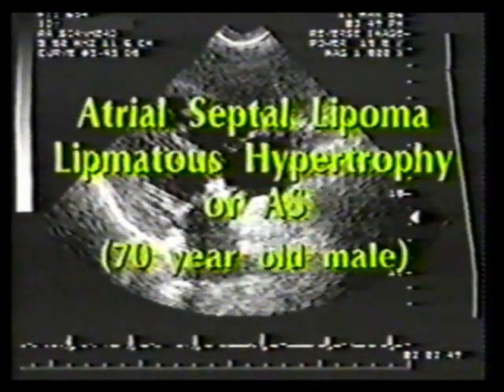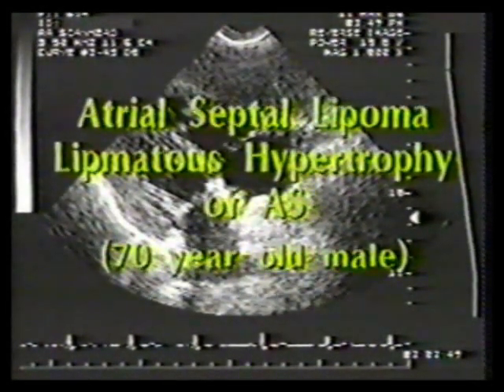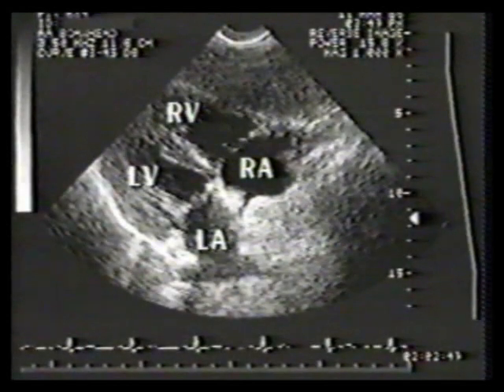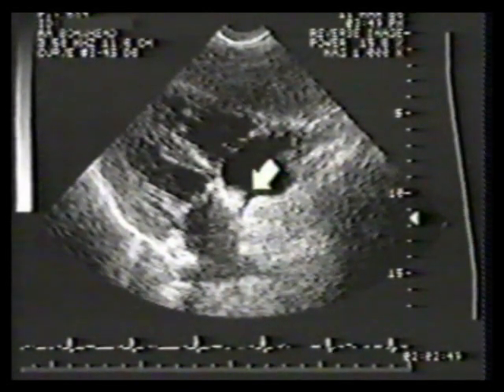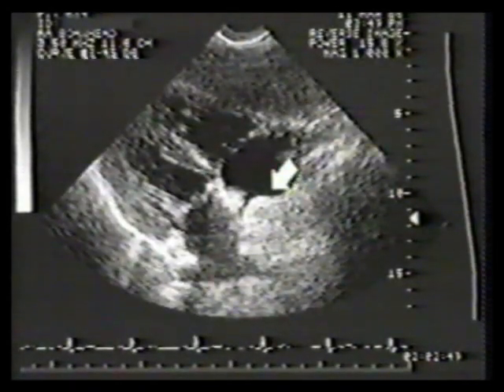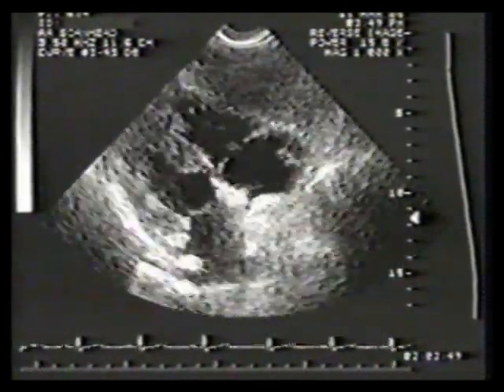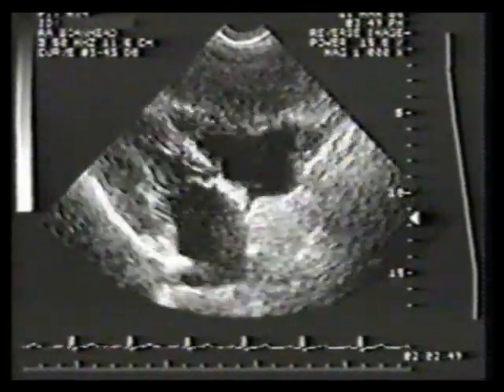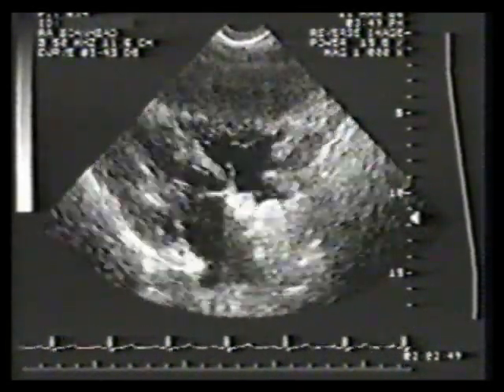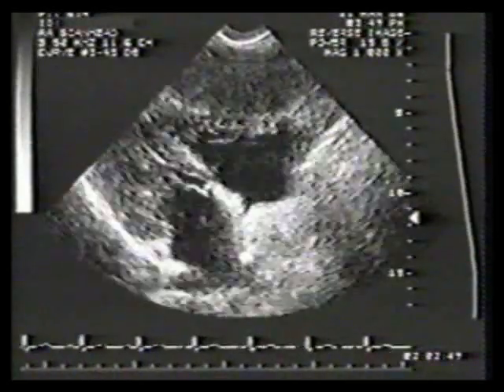This is an example of atrial septal lipoma, or lipomatous hypertrophy of the atrial septum, in a 70-year-old male. This is a subcostal 4-chamber plane of section. Note that the atrial septum is markedly thickened, with sparing of the valve of the fossa ovalis. At the base of the septum, the thickness appears almost tumor-like. This condition is usually benign, although the amount of atrial septal hypertrophy may be quite excessive, but should not be confused with malignancy, atrial myxoma, or other more serious conditions.